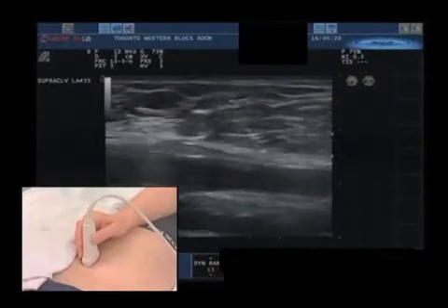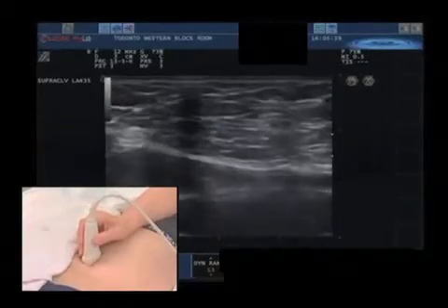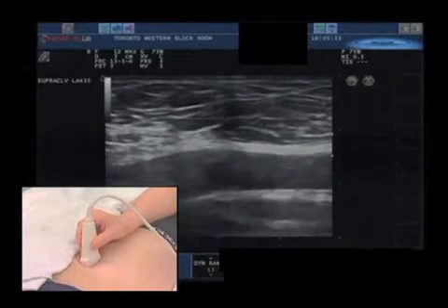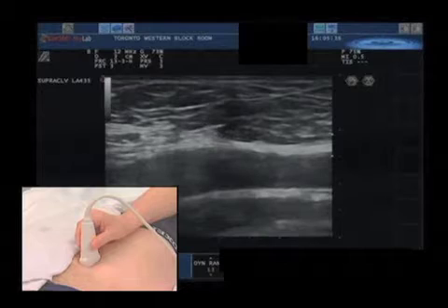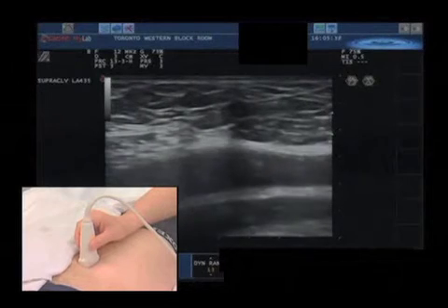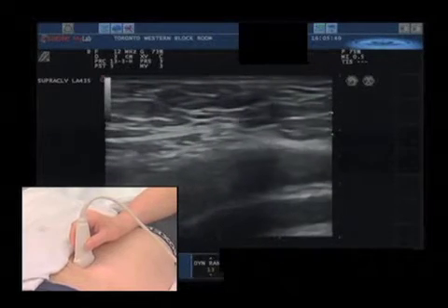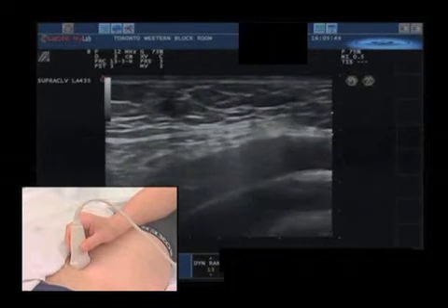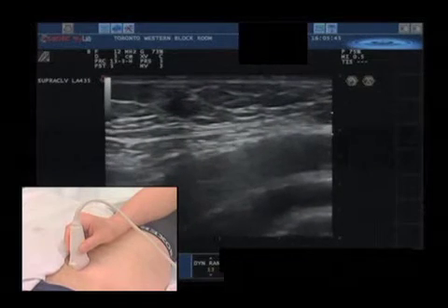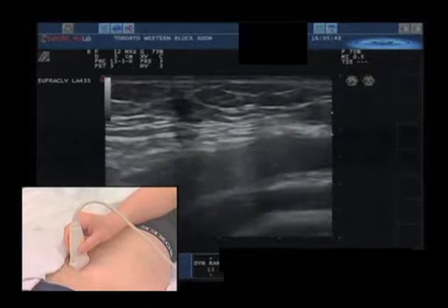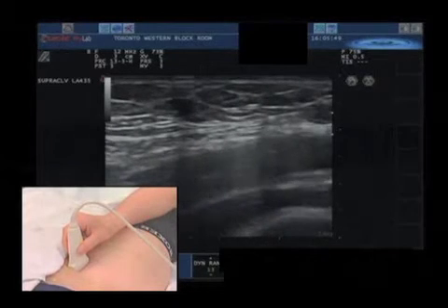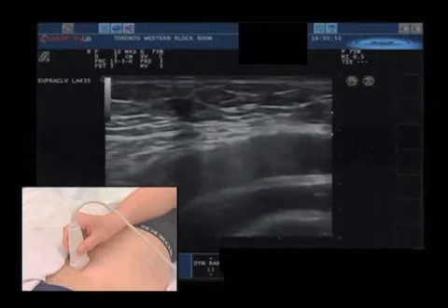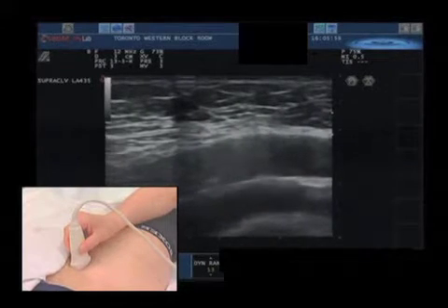If we scan the femoral artery more cranially, we will see that the femoral artery suddenly changes into the external iliac artery. This is very clearly seen because the vessel is suddenly dipping down into the deep area, and this is more or less our starting point — the starting point of looking for the spermatic cord.